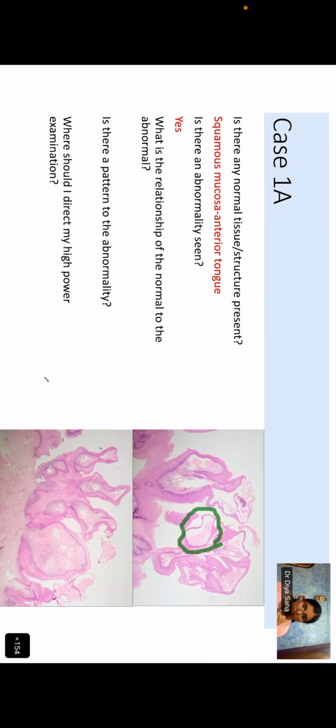That's why. Yes, because this is something that is being cut tangentially, right? So it looks like it is surrounded on all sides by epidermis, but actually it is not, because it has been cut tangentially. You can get a structure that looks as if it is surrounded on all sides, but it is actually subepidermal. I just want to look at so many of these things. If you cut them tangentially over here, what will it look like? And you think that they are intraepidermal?